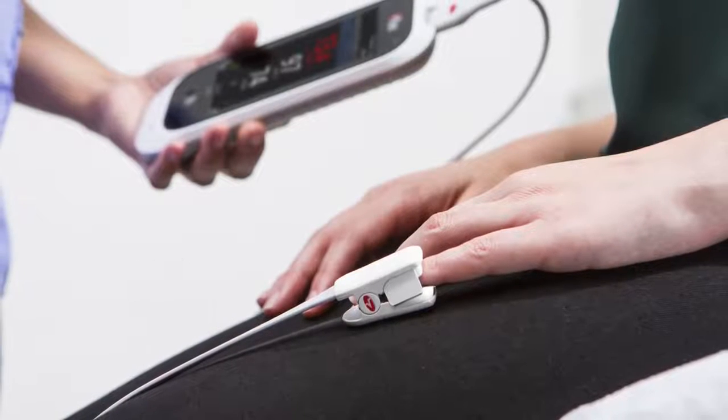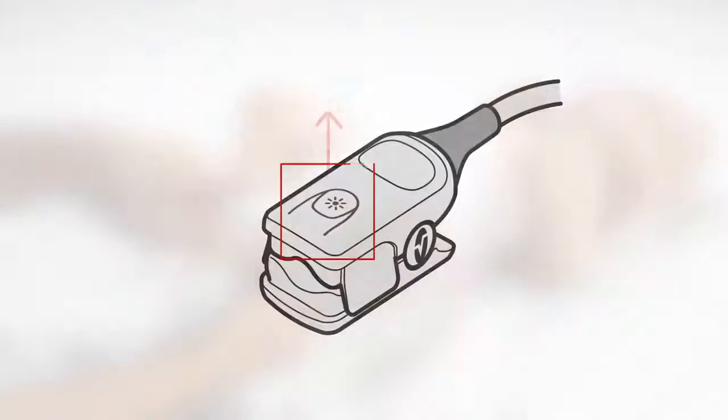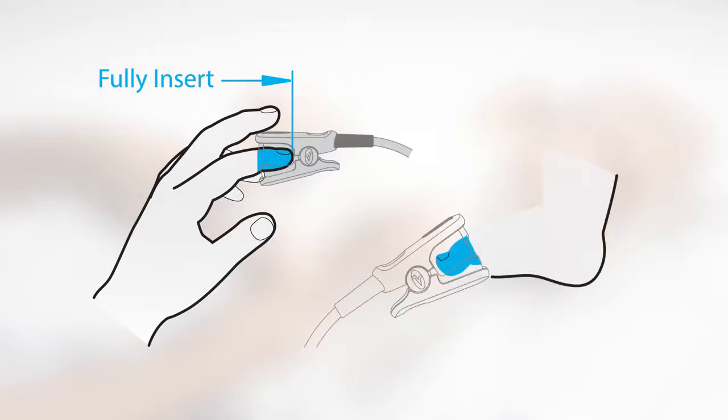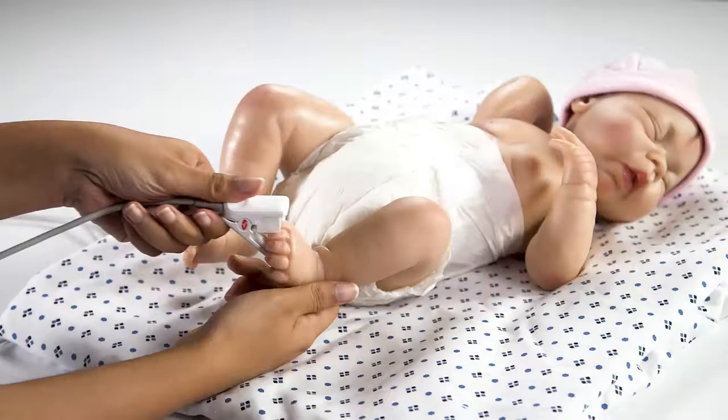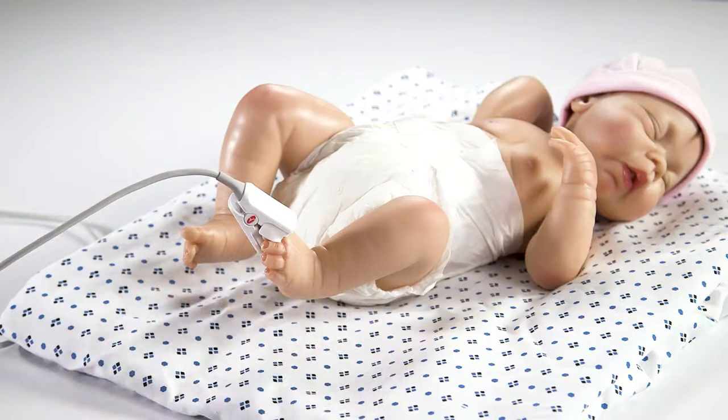However, other digits can be used. To apply the sensor, orient the cable away from the sensor site, making sure that the finger outline is facing upwards. Open the sensor by pressing on the sensor indentations. The fleshiest part of the digit should cover the detector window. The tip of the finger, film, or toe — not the nail — should touch the digit stop at the back of the pad. The sensor should be open enough to evenly distribute the grip pressure along the length of the finger.